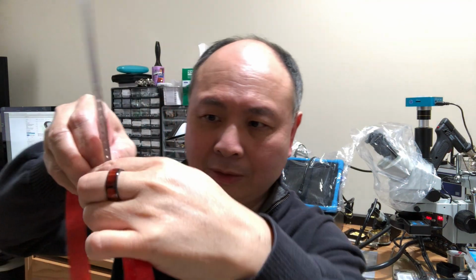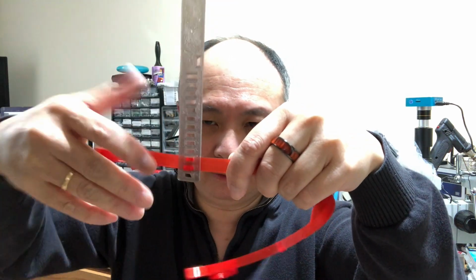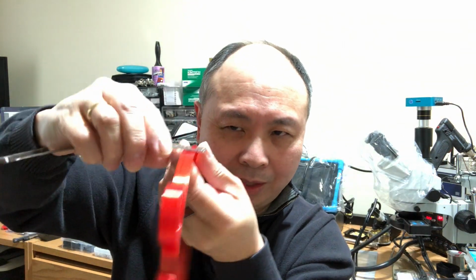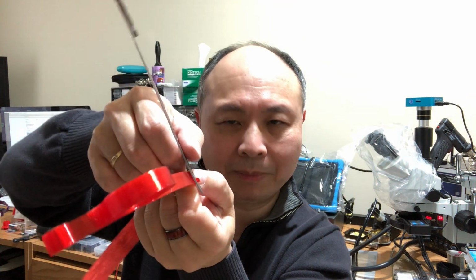So once it's engaged at the bottom, you can then rotate it up over the hook and lock it in place. And that lets you change the height up and down of the fan mount. Now, taking it off is, of course, taking it from the top first, because we want to disengage the top of the hook first.